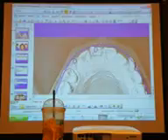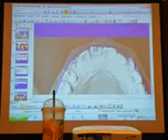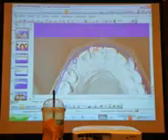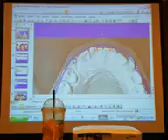Both have a mesial rotation. Okay. Both have a mesial rotation. And what about this cast, the other cast? The other cast, relative to the wire? Distal rotation versus distal rotation.